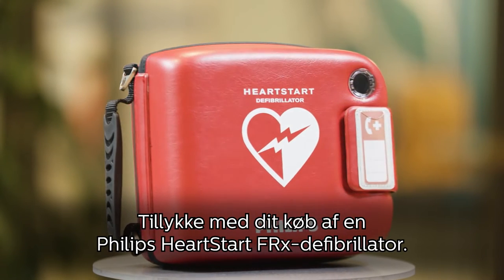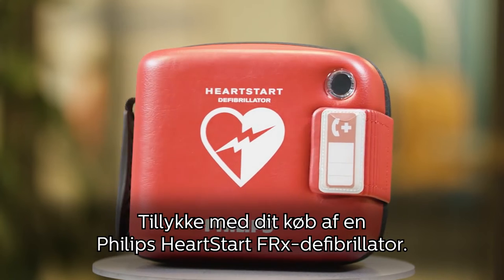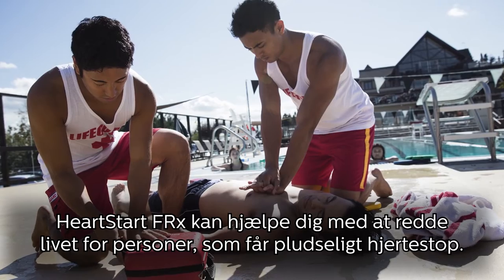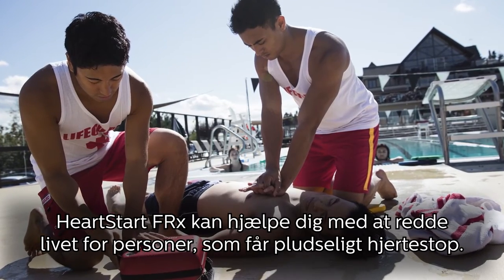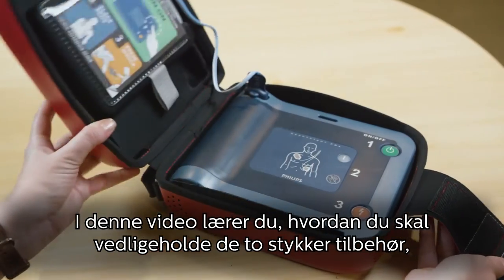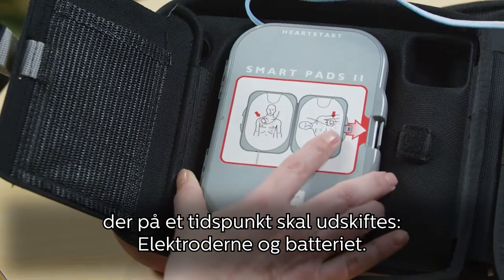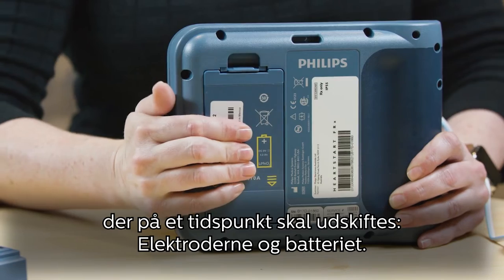Congratulations on your purchase of a Philips HeartStart FRX defibrillator. Your HeartStart FRX can help you save the life of someone suffering sudden cardiac arrest. In this video, you will learn how to maintain the two accessories that will eventually need to be replaced: the pads and the battery.